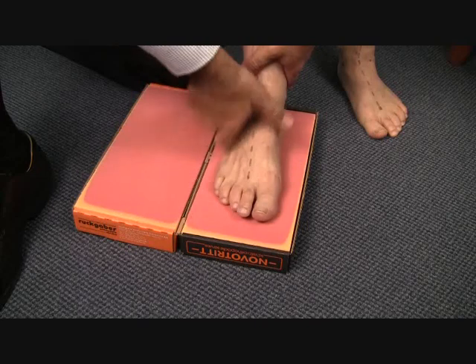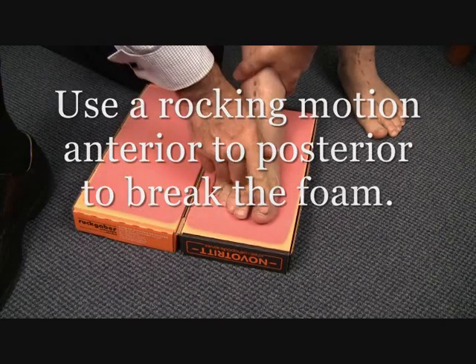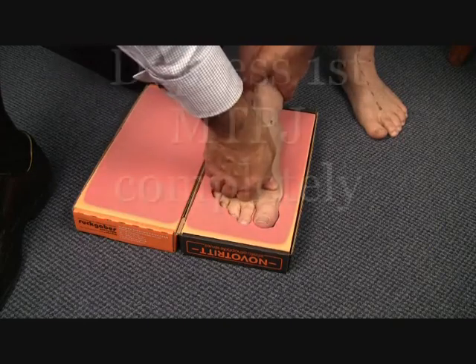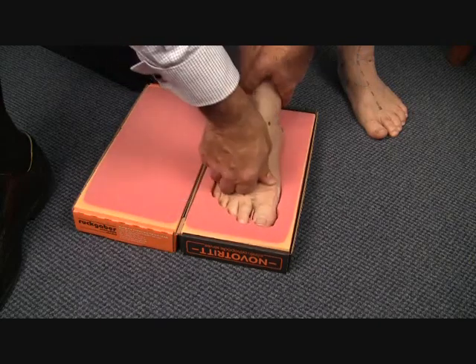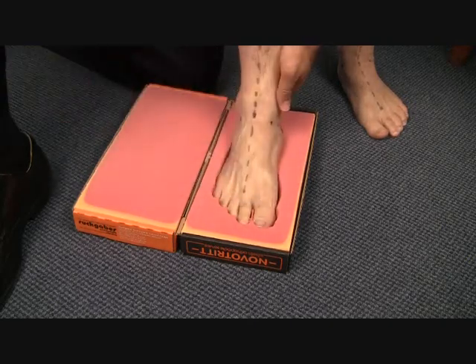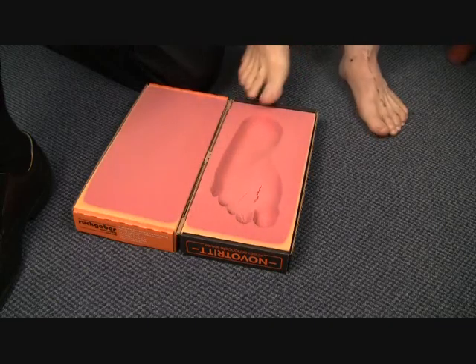Commence the procedure by rocking forward and back in an anterior-posterior motion to break the foam. Then depress the toes, checking and maintaining that the AAM is in the correct position. Depress the first metatarsal joint completely to the base of the foam.